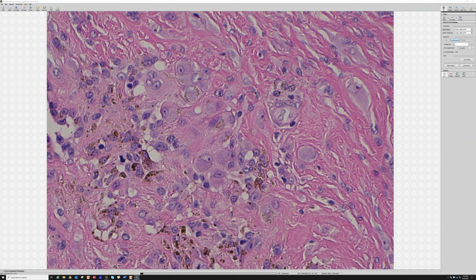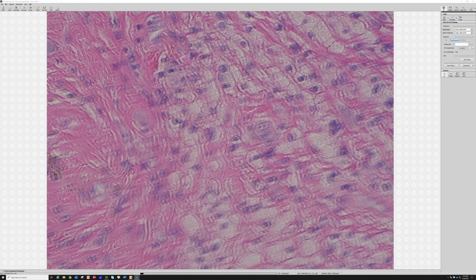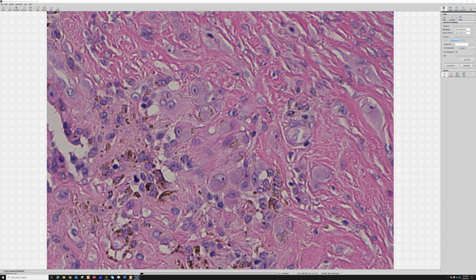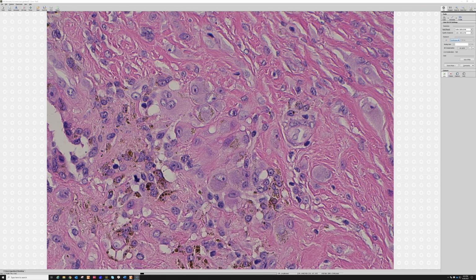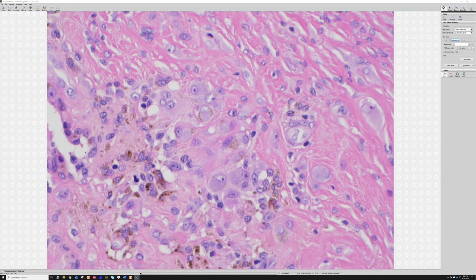And the nucleus is off to the side. It's eccentric. So this is a plasmacytoid, or I almost like to think of them as rhabdoid-looking cells. They're histiocytic looking, but also have an eccentric nucleus. There we go. I bumped the slide. All right. And then look, a couple more of those cells here, each of them having this peripheral ring of hemosiderin. So these are the characteristic cells that you want to see for this tumor.